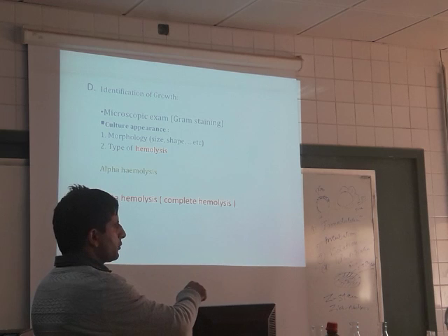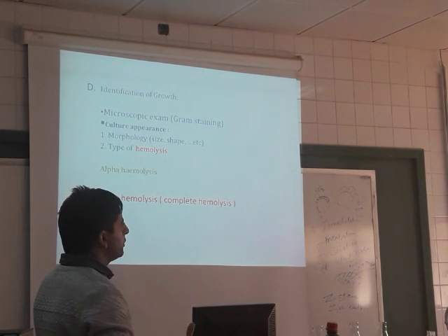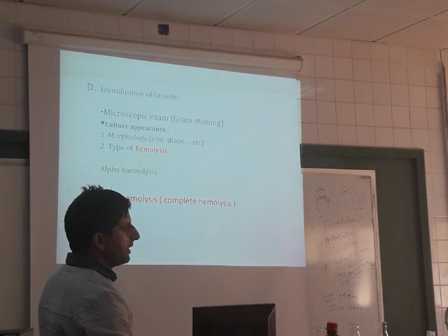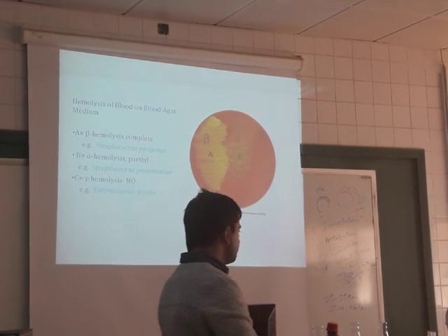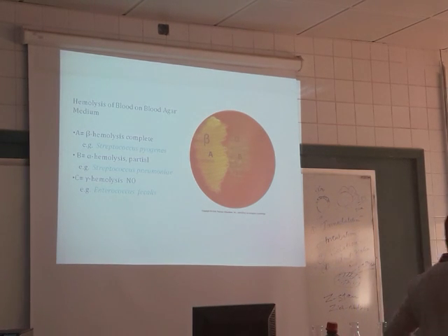Then when you have the microbial culture growth there, you can use it for various types of identification. One type of media is blood agar. What's the purpose of blood agar? Correct. In a short line, the purpose of blood agar is to identify microorganisms, whether the bacteria is lysing, breaking down the RBCs or not. Very simple.